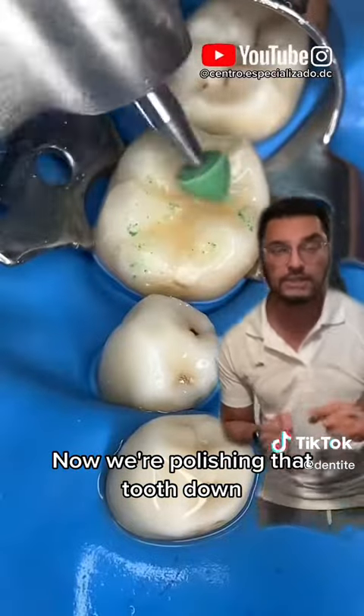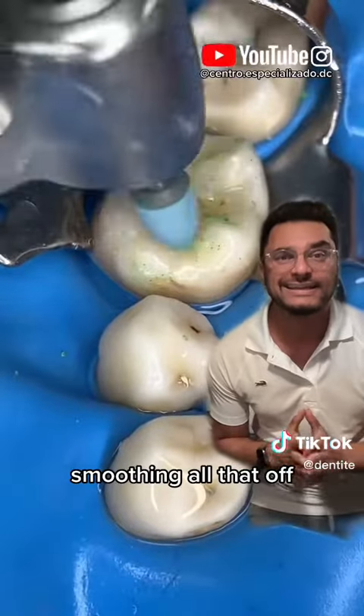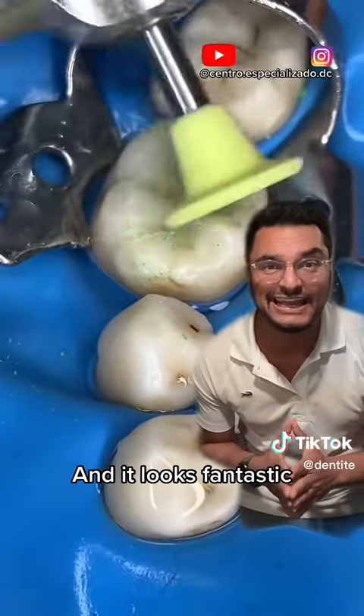Now we're polishing that tooth down with white and green cones, smoothing all that off. And it looks fantastic.